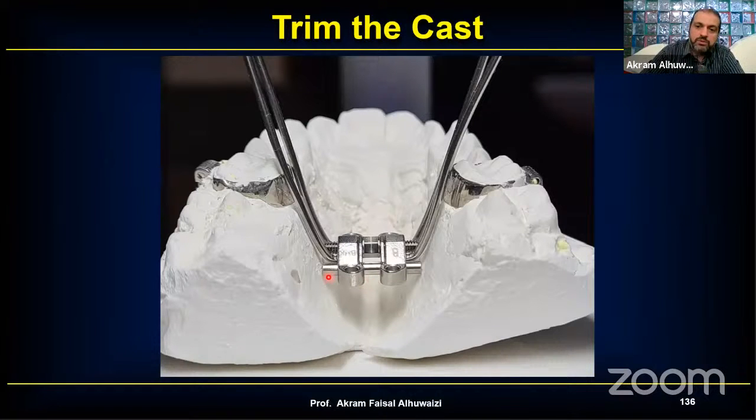But usually if you take this impression out of alginate material and with a stock tray, the area here, from here to here, is going to be quite lengthy. And alginate usually shrinks a little bit. And as it shrinks a little bit, the cast will not resemble exactly the intraoral. So what happens if you cut, let's say, 1 millimeter from here? I'm not saying you cut it so that you can push this all the way down. No. Don't misunderstand me. No.